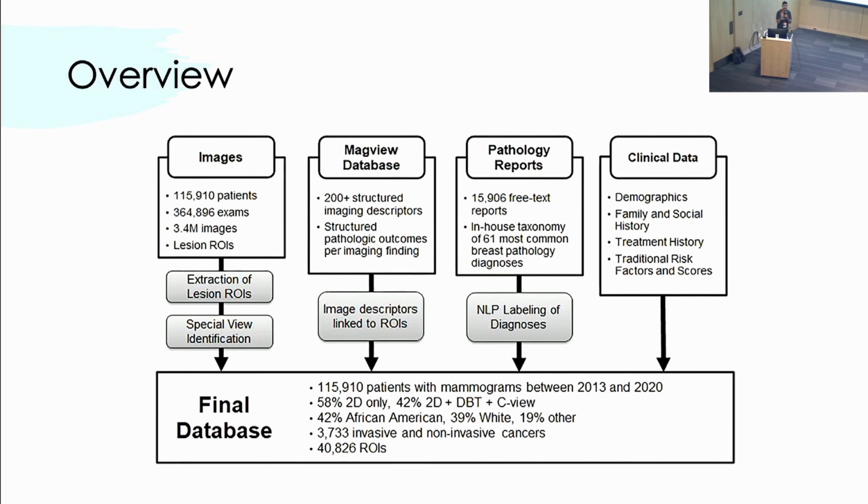So if an abnormality was detected on the image, which would be a BI-RADS, a screening study with an abnormality is a BI-RADS 0. Screening can only be 0, 1, or 2, right? So a portion of those studies that are abnormal on screening will have an actual ROI or lesion location that you can take advantage of during the datathon if you want.